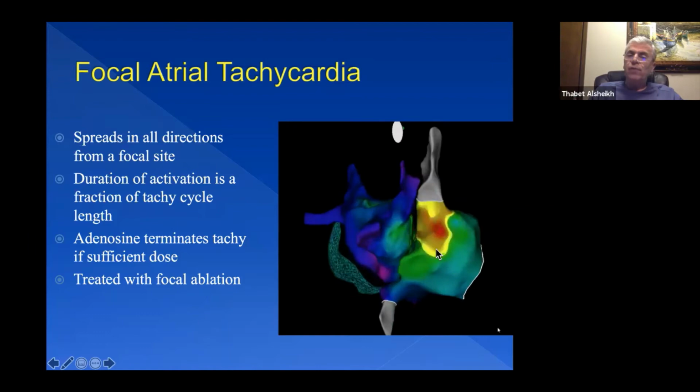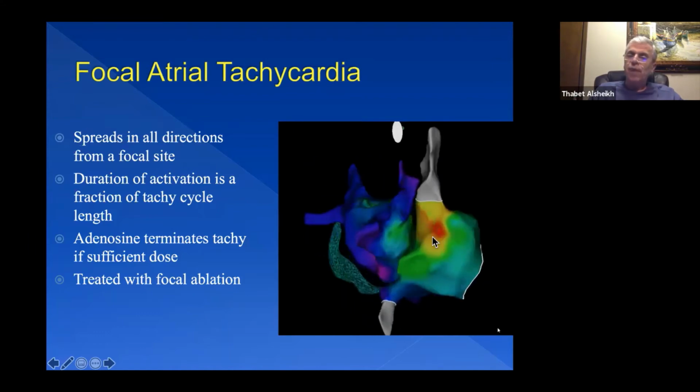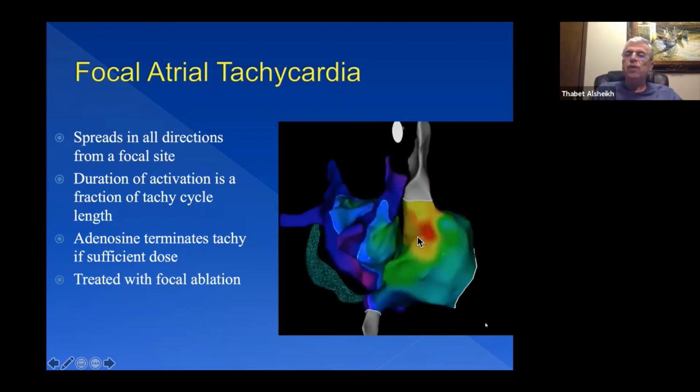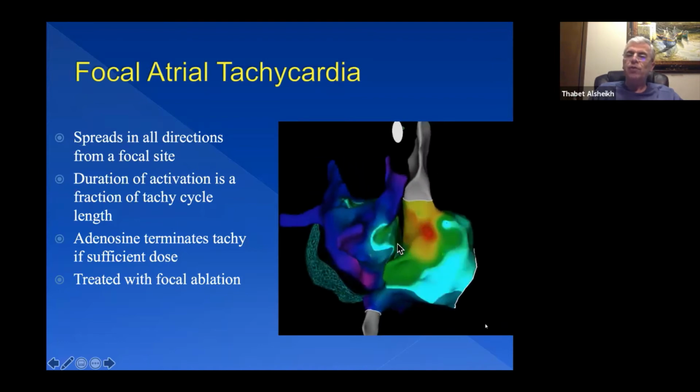And the way to eliminate it by ablation is by focal ablation. If you are on the right spot, one ablation is enough. We usually give additional ablations for assurance, but one focal ablation should be adequate if we are on the spot.